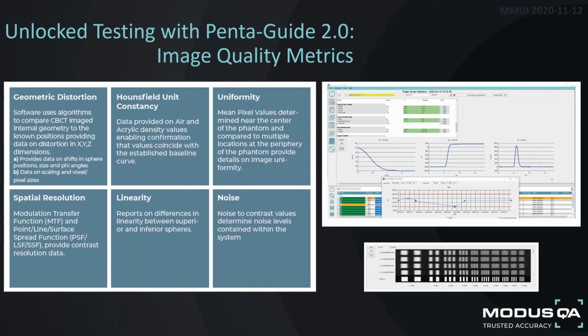Yeah, those new features sound really interesting. Could you explain how users can implement the Phantom and these features into their daily QA workflow?